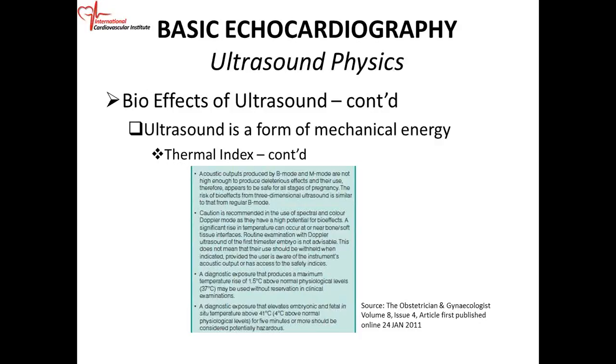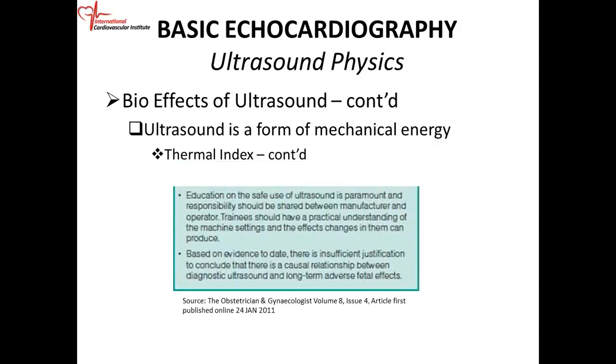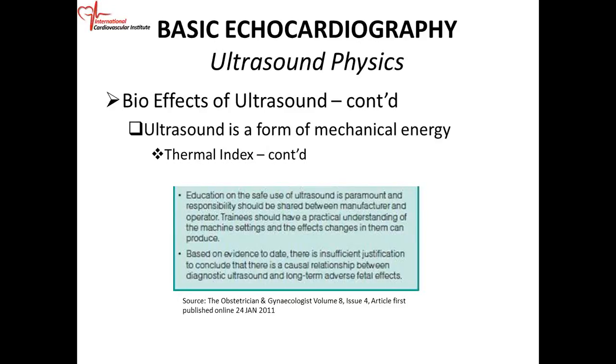Most of the stuff that we discuss is in this paper. So that's basically most of the stuff that you need for ultrasound physics. We still have to do artifacts, and we will set a time where we'll probably spend one session on artifacts, because if you're doing a scan, you should know what is real from what's not real.